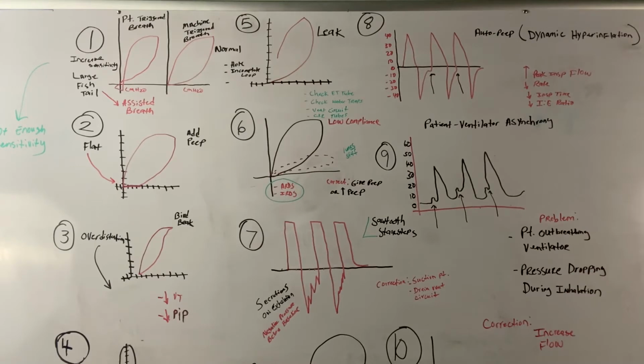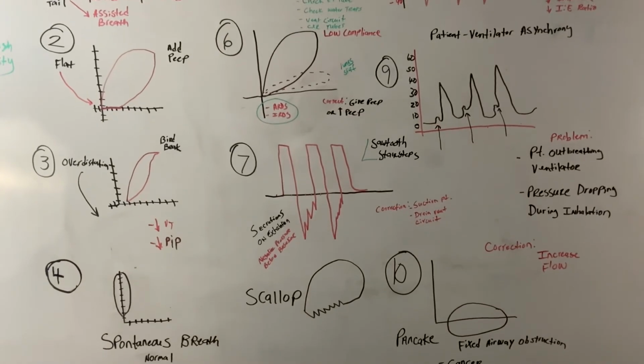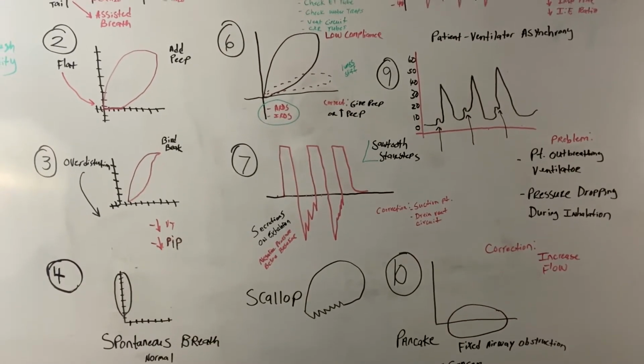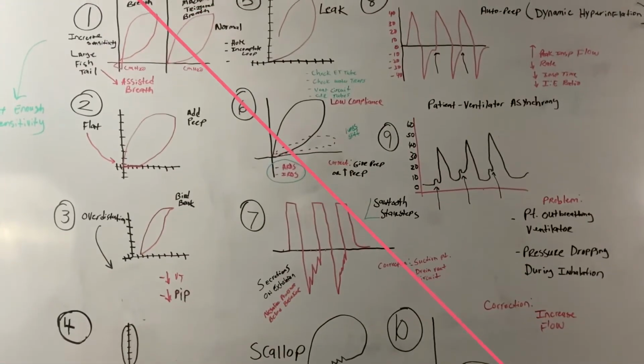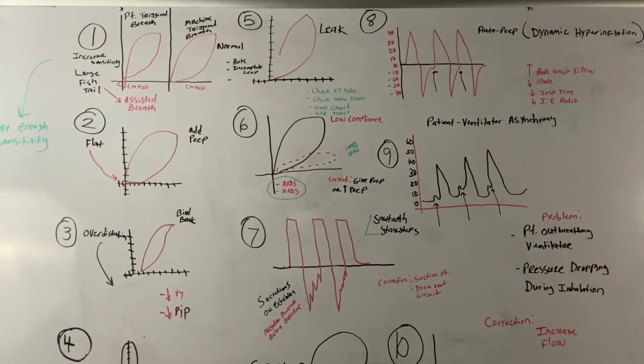There is one ventilator graphic, I don't know if you can see it, we're going to try to focus it in down at the bottom, that is a spontaneous breath, which is normal. Every now and then, NBRC will want to throw that in on you.